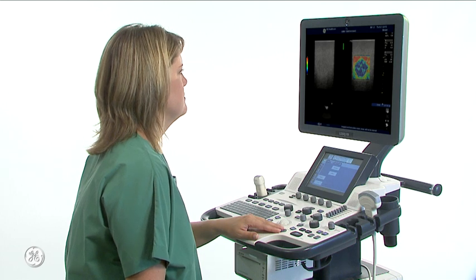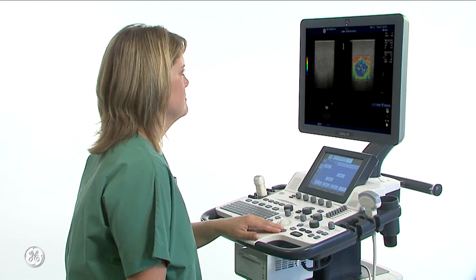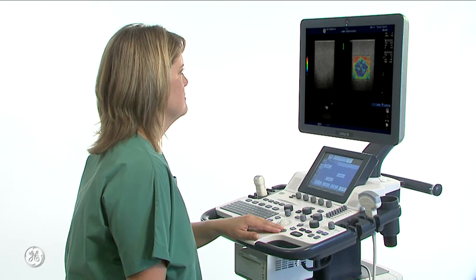Elastography shows the spatial distribution of tissue elasticity properties in a region of interest by estimating the strain before and after tissue distortion caused by external or internal forces. The strain estimation is filtered and scaled to provide a smooth presentation when displayed.